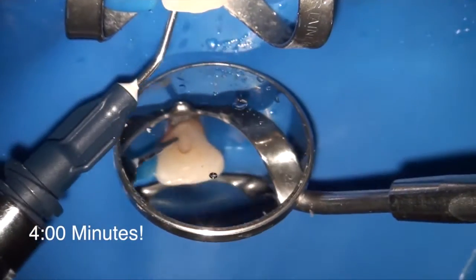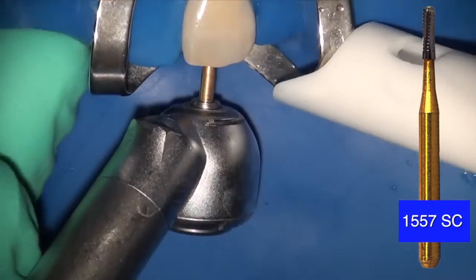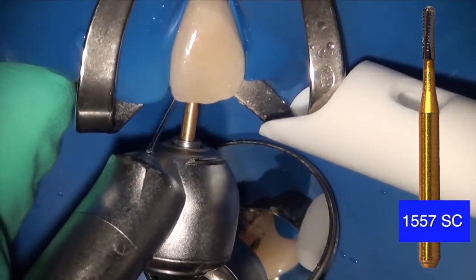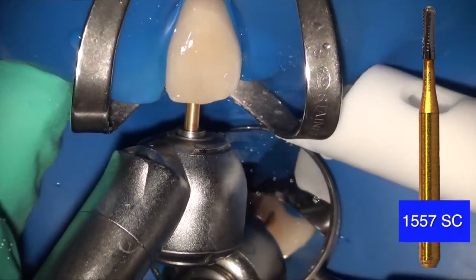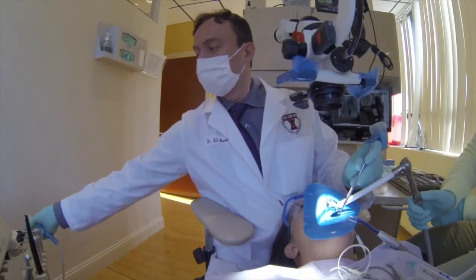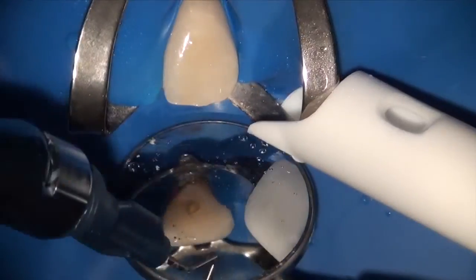After almost four minutes of cutting in such manner, I'm only through about a millimeter and a half or two millimeters of the lithium disilicate. Now I'm into dentin, and therefore I switched to the 1557 burr that is also in the Real World Endo Access Kit. This Saber Cut burr is very efficient in terms of cutting and getting through the dentin. After a few quick strokes, I'm already through the roof of the pulp chamber, and then I move on to use the Forza V3 Ultrasonic.